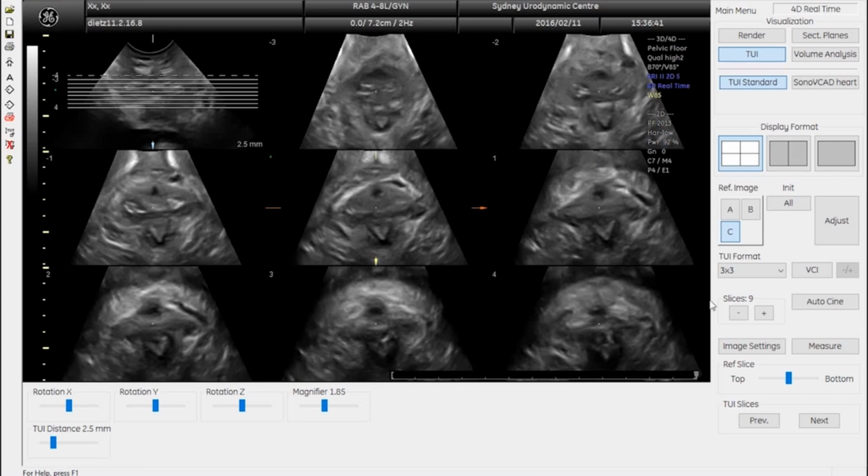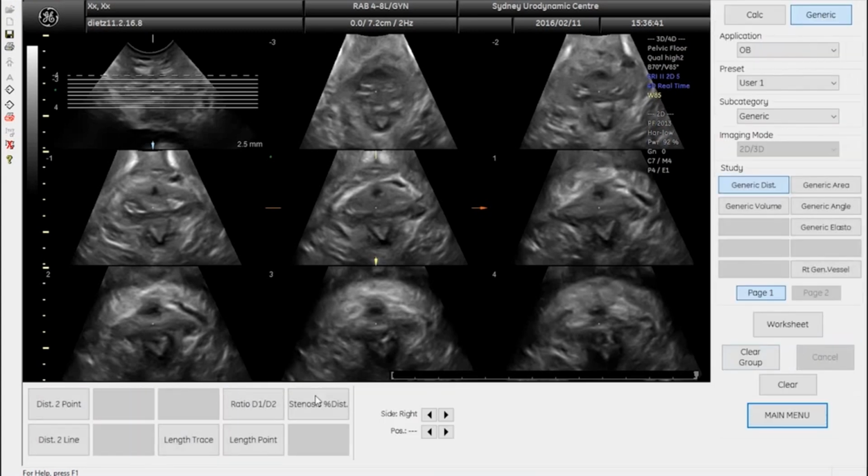And really the last thing to do is to measure the levator-urethra gap, which is obviously highly abnormal throughout those slices. So you measure from the center of the urethra to wherever you can first pick up some muscle. So here and there, and somewhere there, and here. And it's plainly obvious that all those measurements are highly abnormal, the limit of normal in Caucasians being 2.5 centimeters. So we call that a complete bilateral avulsion.